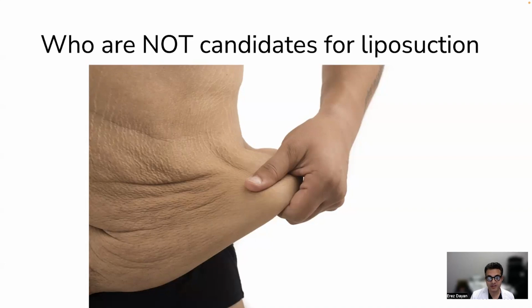So our ideal patients for liposuction are patients that have an ample subcutaneous layer of fat and good skin elasticity, so that we know once the volume's removed, the skin is going to adequately contour to the proportions that you've created with the liposuction. Now, sometimes patients can be in the middle ground, and in the second portion of this course, we're going to discuss different radiofrequency technologies that allow energy-based skin tightening for those patients that may be in the middle ground with skin laxity.